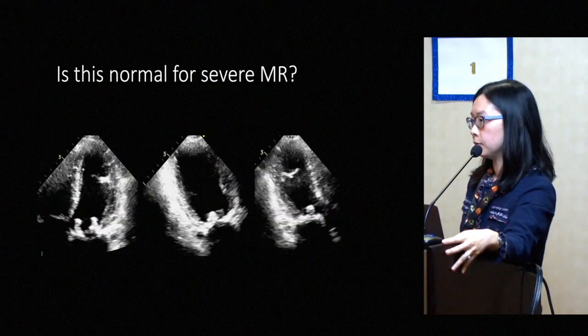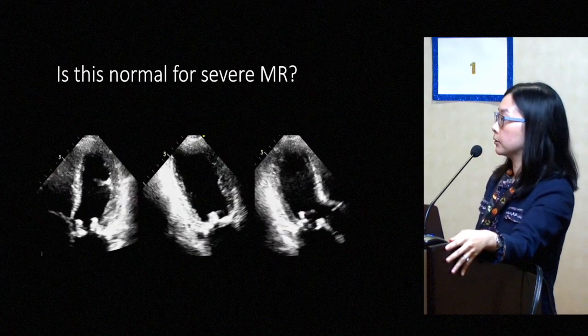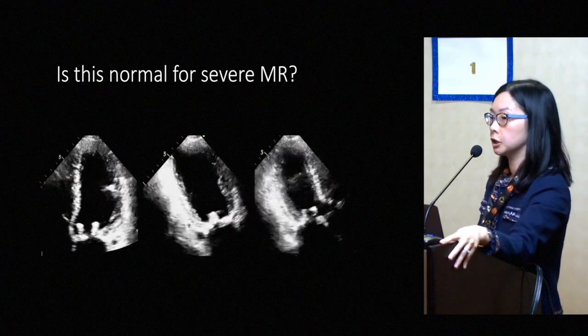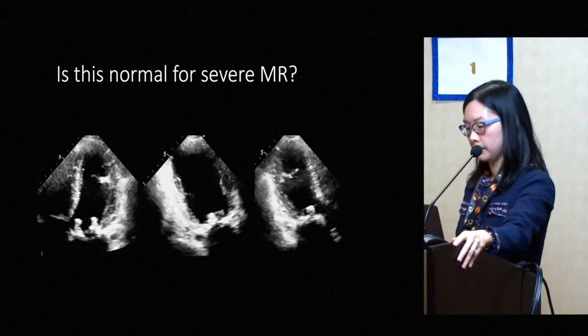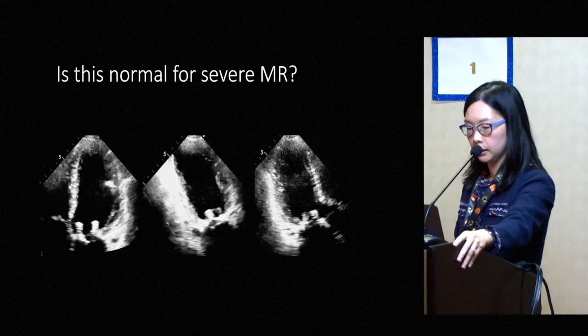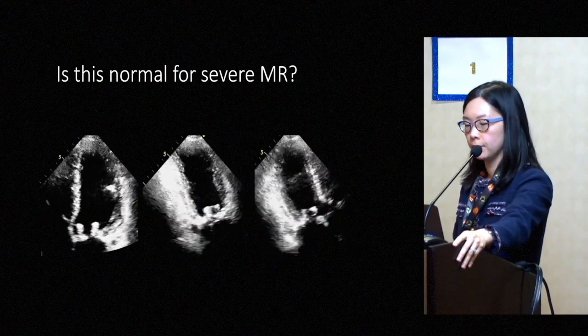So often, if you see someone with a normal EF reported by the echocardiographer, it probably is actually reduced, and we have to keep reminding people that we're not dealing with normal LVEFs. In this patient, we got a little bit lucky. There is a bit of a deterioration in LV function after the valve-in-valve went in, but it's still not that bad.